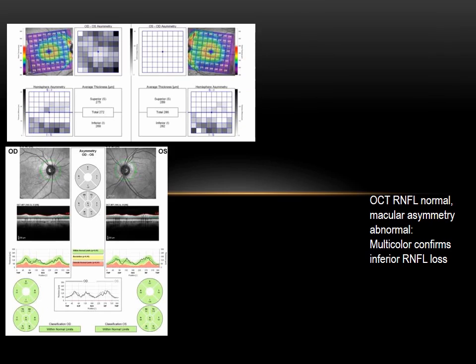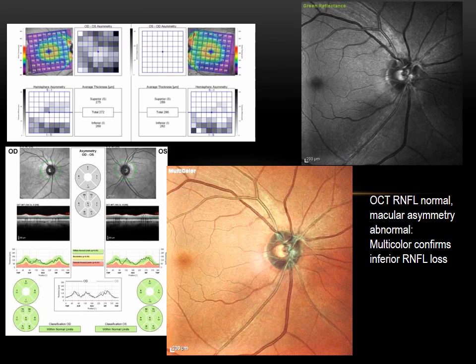This is an example of a patient with normal classified nerve fiber layer thickness in both eyes on OCT. However, in the macular thickness maps it became obvious that the right eye thickness was lesser compared to the left eye. We weren't sure if this was pathology or normal variation, but multicolor imaging confirmed inferior loss of the nerve fiber layer, with green reflectance also showing early superotemporal nerve fiber layer losses.